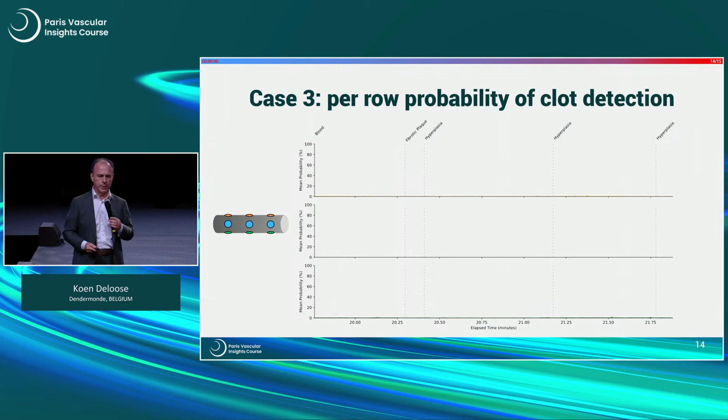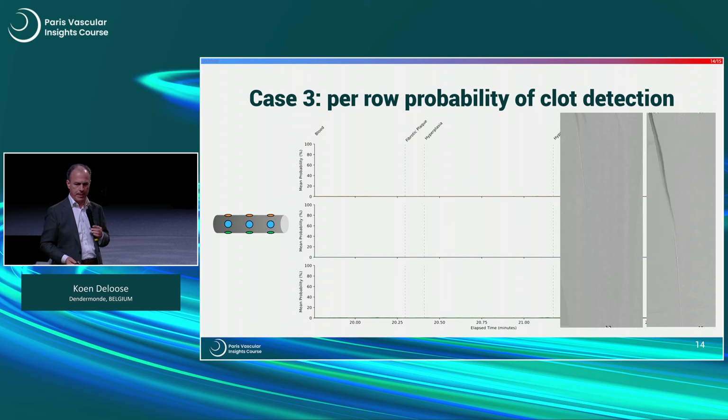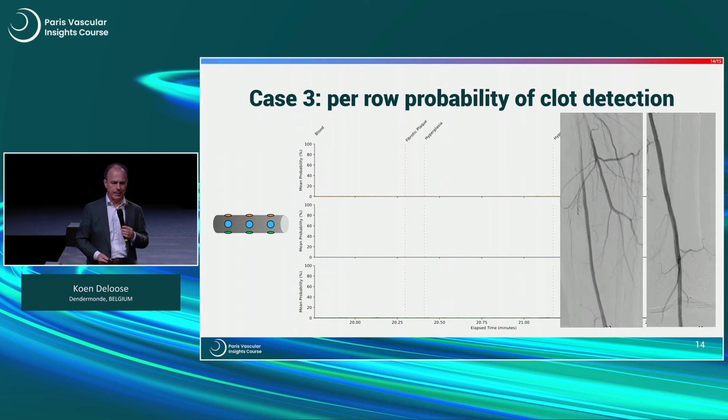And so what was Clotild saying? Here you see the detection. There was no detection of clot at all over the full length of this lesion. And this was the final result post-DCB treatment without any distal embolization.